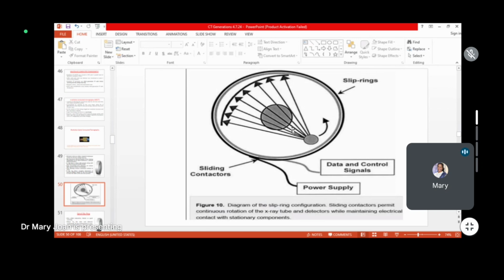So this should allow the electrical contact to remain, and at the same time movement is without any boundary of cable length or time for rotating, moving from one position to another. The only problem here is the time consumed from slice to slice, the translational movement. How much time it takes for the translational motion actually takes the time for the imaging.